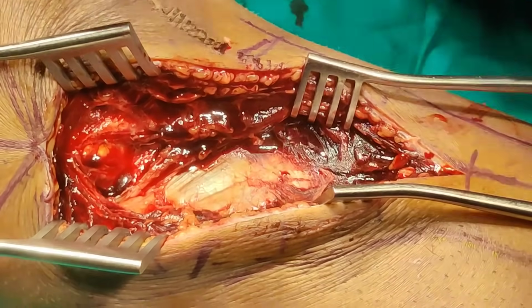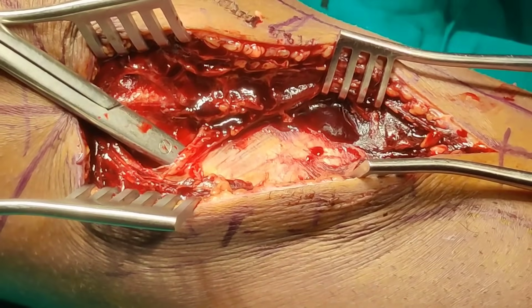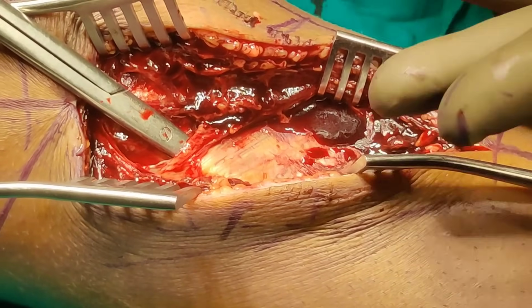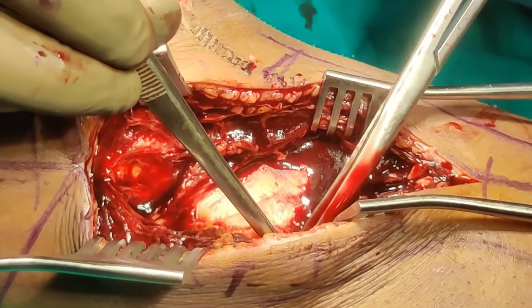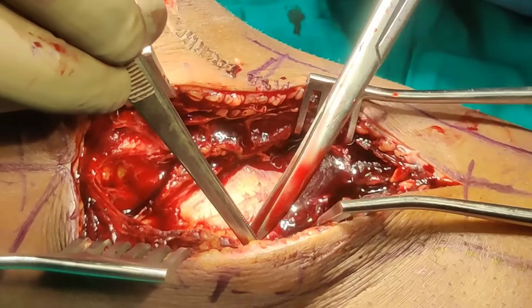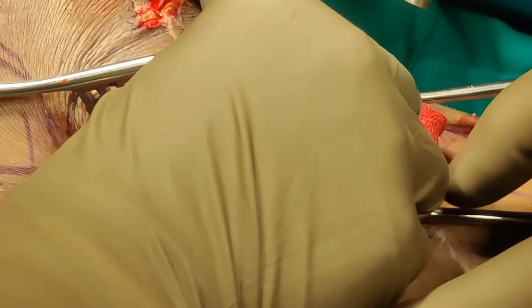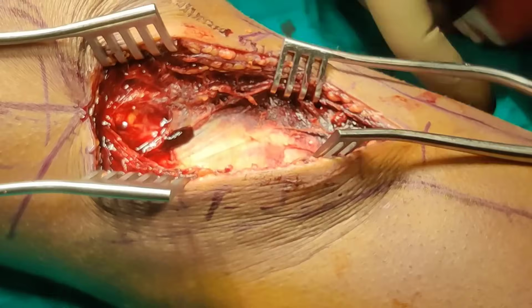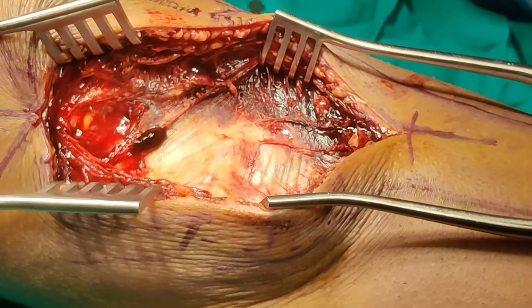So once you see this shiny structure, this is the pes. This is what, when we are doing ACL, we dissect and try to identify the different tendons and then do it. So I'm just going to raise this flap on top of the pes, and it's not a bad idea to just use a swab and give it a good swipe. So just a good swipe in the back and a good swipe in the front, and then you start seeing this shiny structure in the front. So this is all pes.